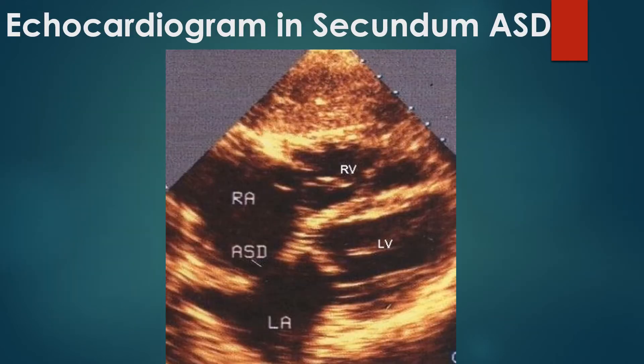Echocardiographic image from subcostal 4-chamber view showing an ostium secundum atrial septal defect. Subcostal view is the ideal view for imaging ASD to exclude false echo dropouts, which may be seen in apical 4-chamber view. This is because the imaging ultrasound beam is perpendicular to the septum in subcostal view, while it is parallel to the atrial septum in apical 4-chamber view.